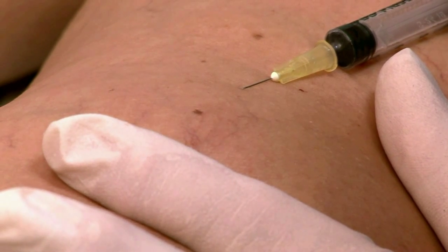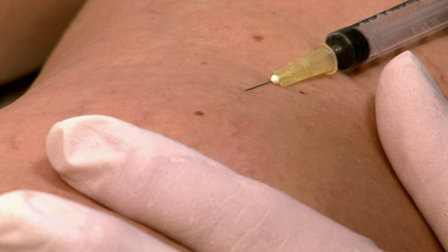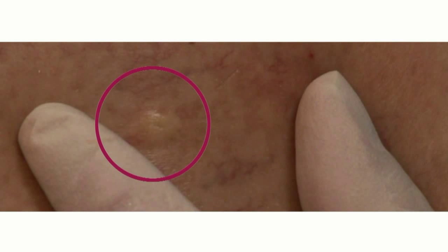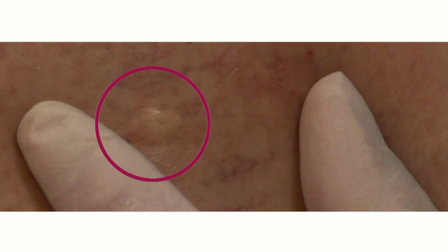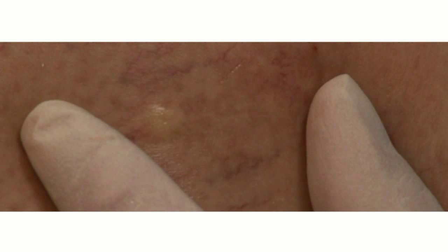In order to prevent side effects, the application of strong pressure should be avoided during the injection. Paravenous injection results in the development of a wheal. In this case, the injection must be stopped immediately, and also if the patient complains of severe pain.